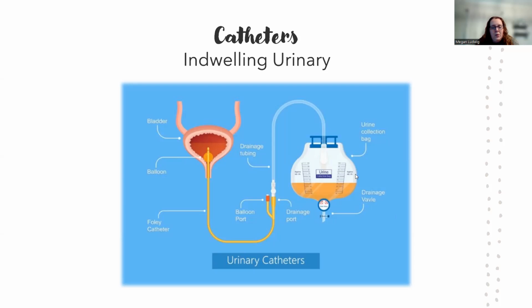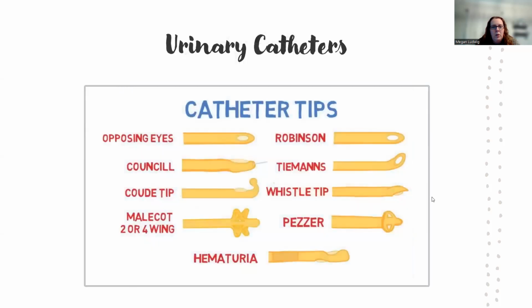And then a drainage valve, if it gets too full, if we're in surgery, our circulator will save the saline bottles or anesthesia, and they'll empty it into that. It's just kind of an easy little thing to empty it into. And it measures it.